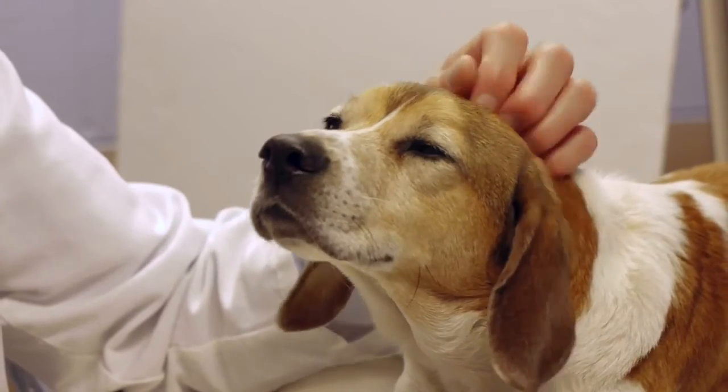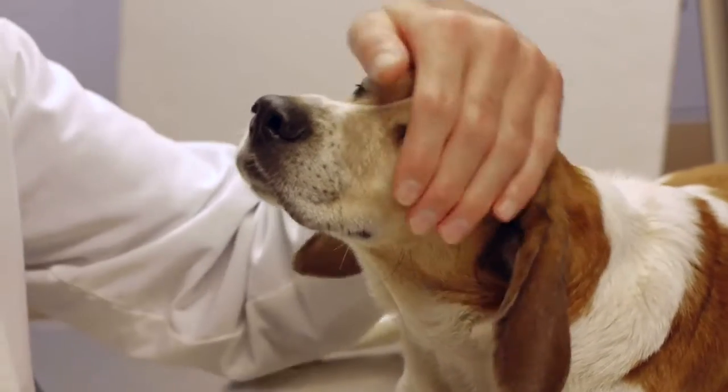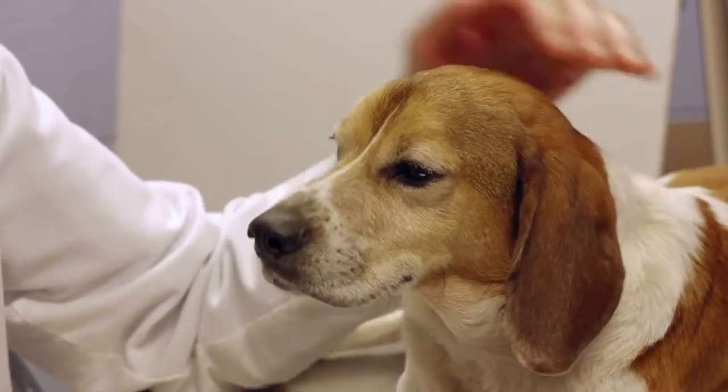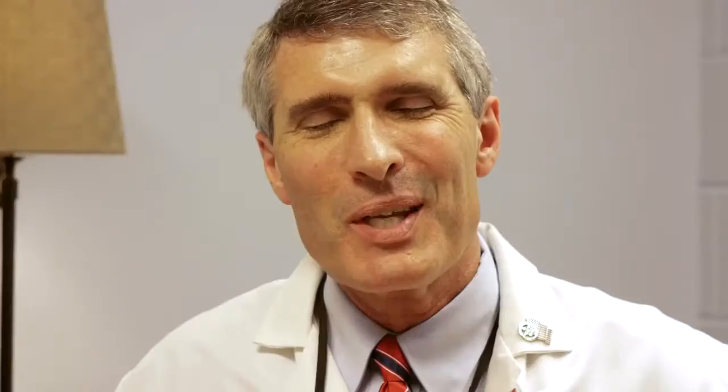This technology is extremely well received, not only by the patient, but also by clients. The pet doesn't have eye drops. The pet doesn't show any signs of struggling. The client feels comfortable. They don't see the air blast that they're used to at their own ophthalmologist, which is very distressing. This is a very, very calming, soothing way of checking pressures on a patient.